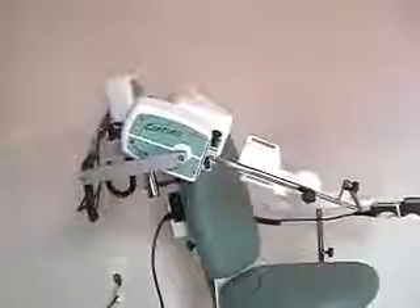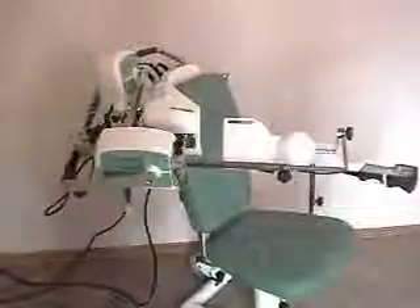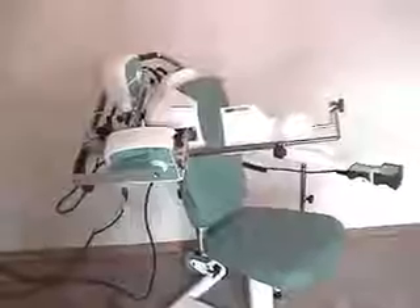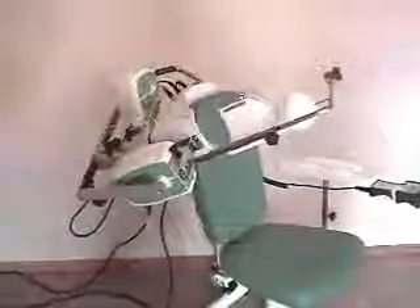Then begin just rotation — internal or external — as we're doing now. So you can see abduction is held in place with the first motor, and the second motor is the only one showing any motion.